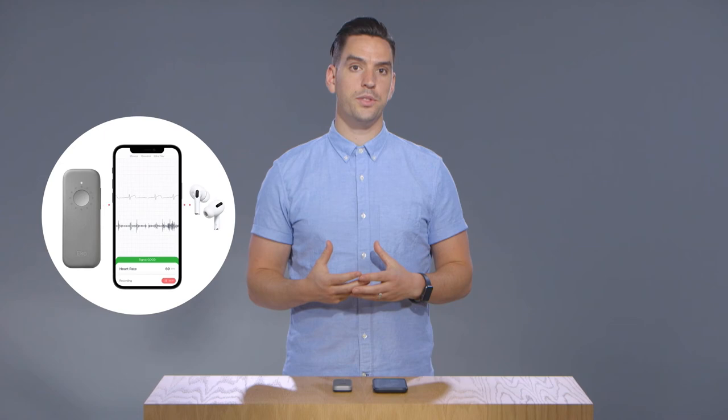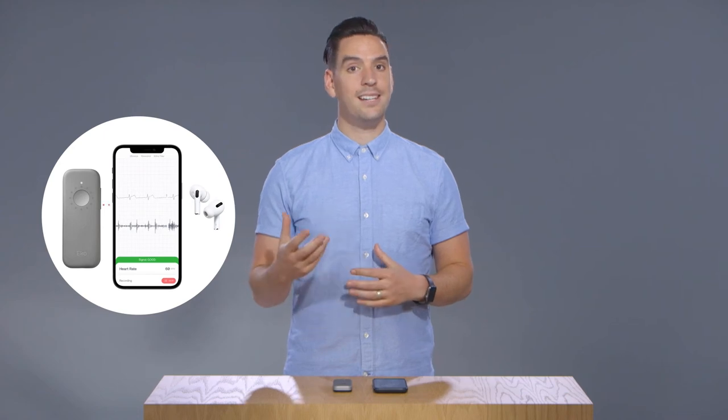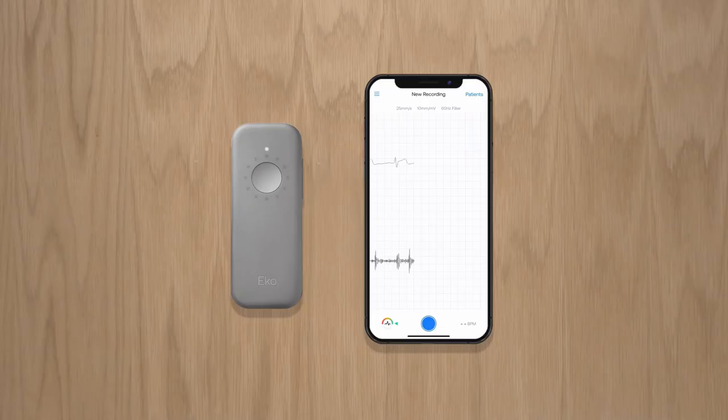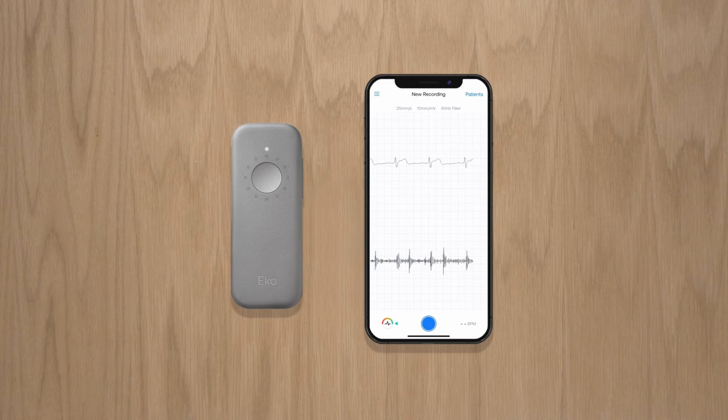You can also activate Play From Headphones which allows you to listen to auscultation sounds from your connected headphones rather than the Duo earpieces. Click the arrow to return to the visualization screen.